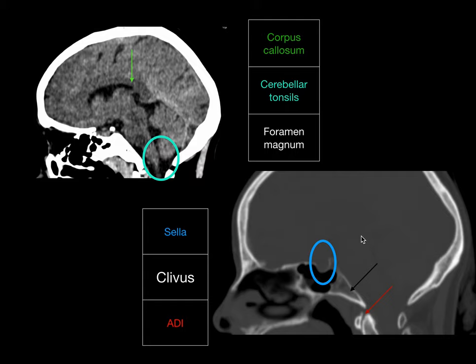Sagittal image reconstruction is very important nowadays with the advent of MDCTs. Sagittal and coronal planes are a must. You can clearly see the corpus callosum — look for any thinning, as pericallosal lipomas are usually missed on axial planes.